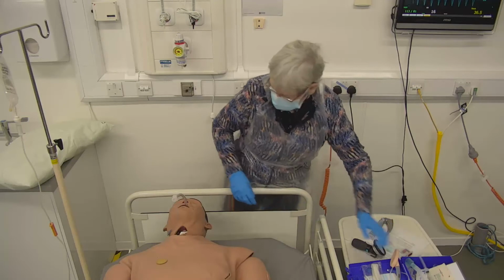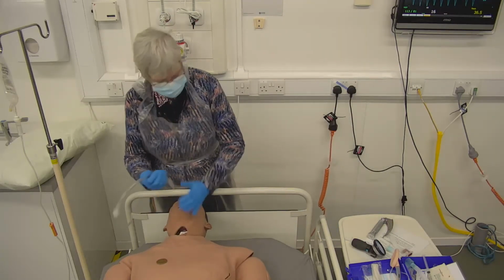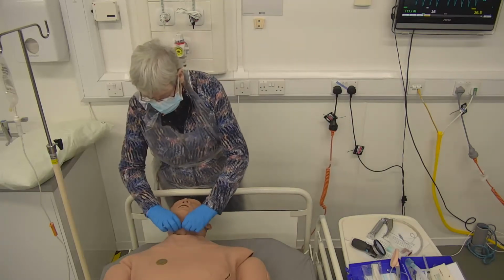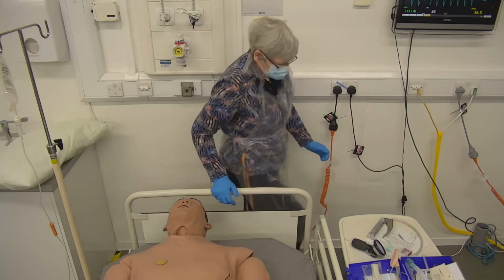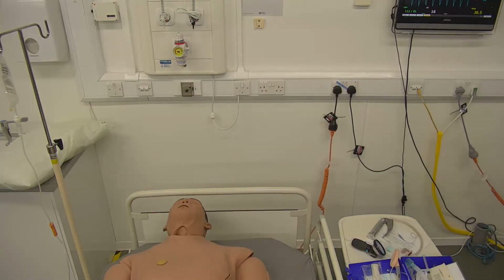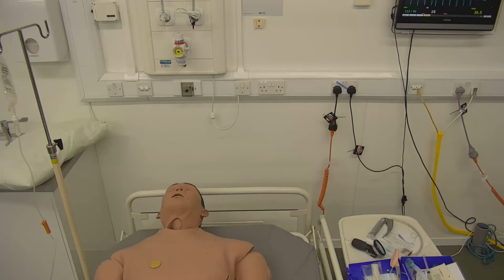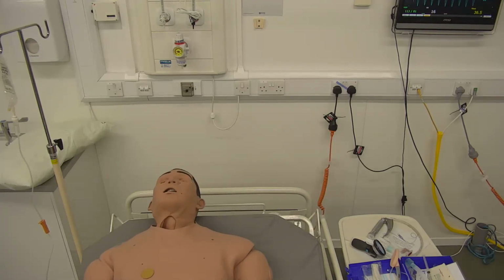And I might just sit Mettiman up a little bit. I'll just slide that out. There we go. Okay, and that's very much how you do remove somebody's endotracheal tube. Take down the cuff and slide it out. I'm just going to sit him up a little bit more so that you can see me work his tracheostomy. So that's in there.